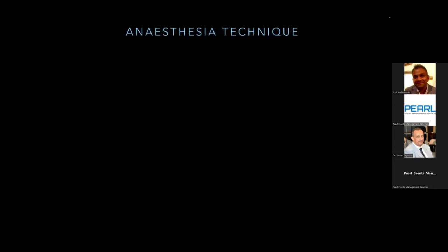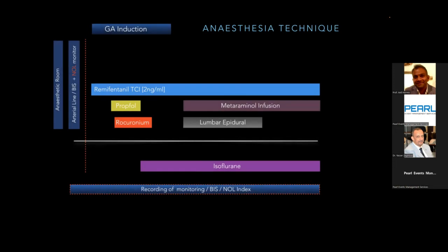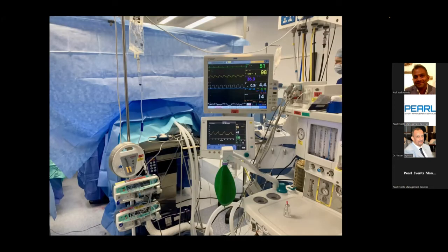So the technique that I used for this lady was I took her to the anaesthetic room. She had an arterial line placed. She had BIS sensors put on, as well as the NOL monitor. I did a remifentanil induction with propofol and rocuronium. I then turned her onto her side, placed a lumbar epidural, and started a metaraminol infusion. This particular lady was run on isoflurane throughout the case.